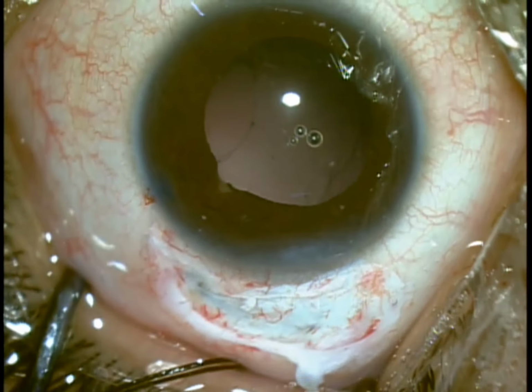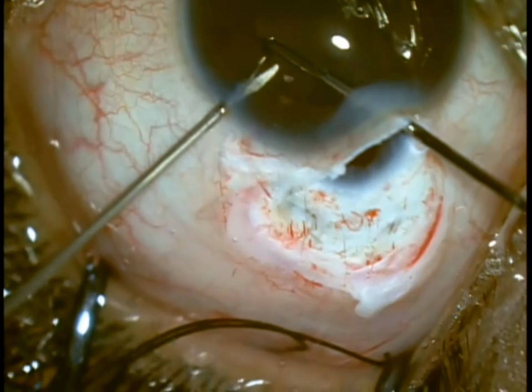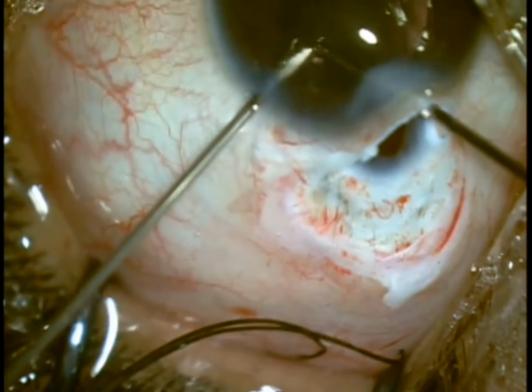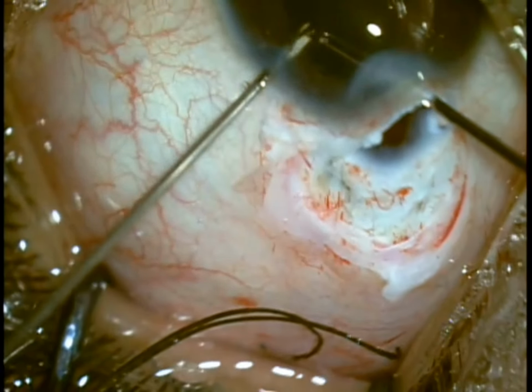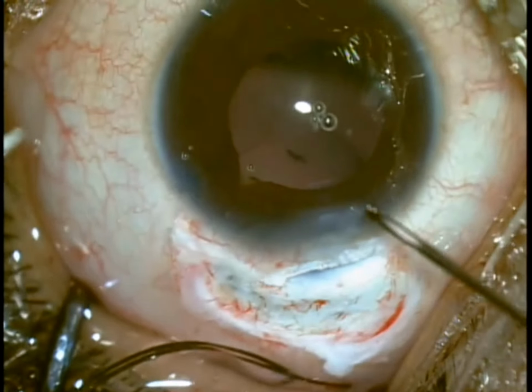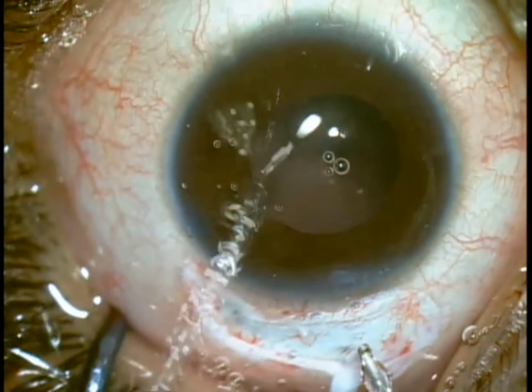The part of the cyst behind the iris is grasped with micro forceps and cut with micro scissors. Anterior vitrectomy is further done.